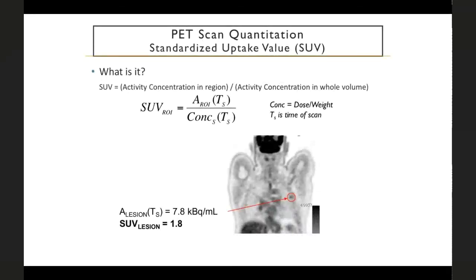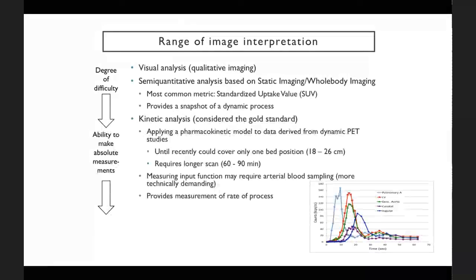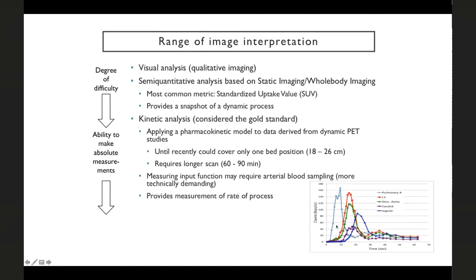So let's talk about standardized uptake value. Could I ask a really quick question, Janet? That just sounded so appealing. That means that with the Explorer, the need for arterial sampling would be almost eliminated, right? Correct. In principle, yes. That's so very appealing. Getting in the A line and doing all of that, a pretty heroic multi-person event, is removed. So I just wanted to highlight that. That's just so very cool.